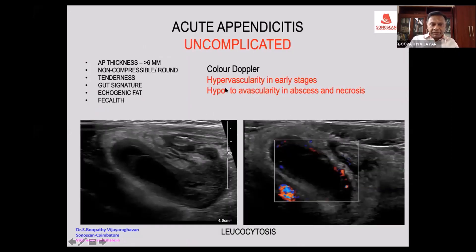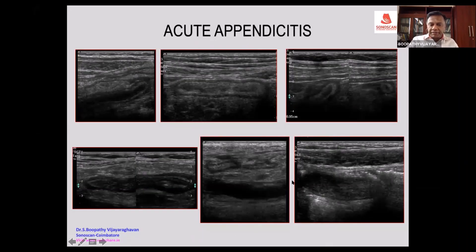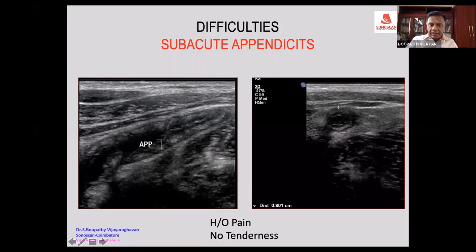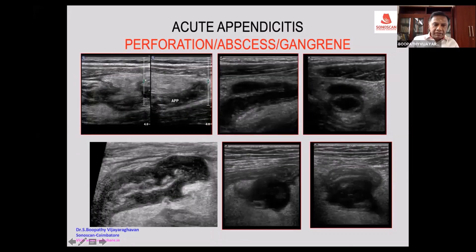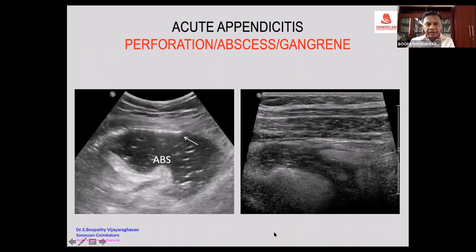The role of color Doppler: when you do color Doppler, the lumen may appear filled with pus. The wall thickening may not be well seen, but the lumen is filled with pus. The AP thickness is 8 millimeters. See the discontinuity in the wall of the appendix. There is also some fluid accumulation anterior to the appendix in cross-section — that represents an abscess.